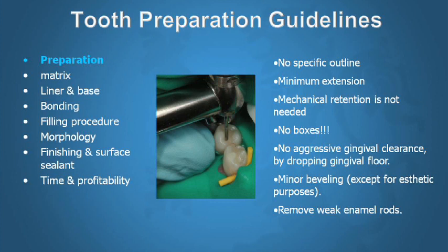Beveling is really not necessary, because although research clearly shows that when you bevel 45-degree enamel you increase your adhesion, it's all academic. A few megapascals doesn't make any difference. Clinically, it's not going to do anything.